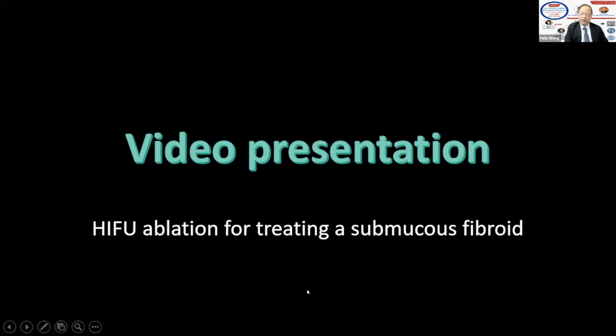But before I begin, I may explain some of the operating system, because there are people who are very experienced and other people who may have just started to learn HIFU or may not have seen a HIFU system before. So I would like to spend a little time presenting the operating system and what we are looking at. Also, I did speed up the video to save time. For those who are very experienced in HIFU, please excuse me because I'm not as experienced as you are, but just give me good comments about this case, okay?